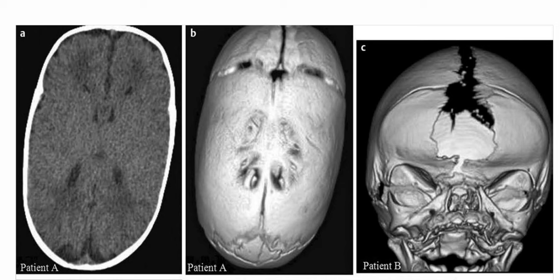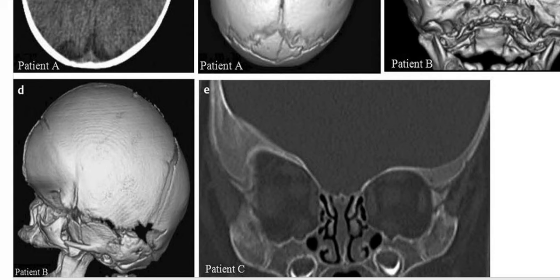The frontal reformatted CT scan in this 5-day-old girl shows premature closure of the coronal sutures with brachycephaly, a prominent forehead, and midface hypoplasia. In the third patient, the coronal CT scan in a 4-month-old boy shows uplifting of the right orbit with a harlequin eye deformity from unilateral coronal suture craniosynostosis.